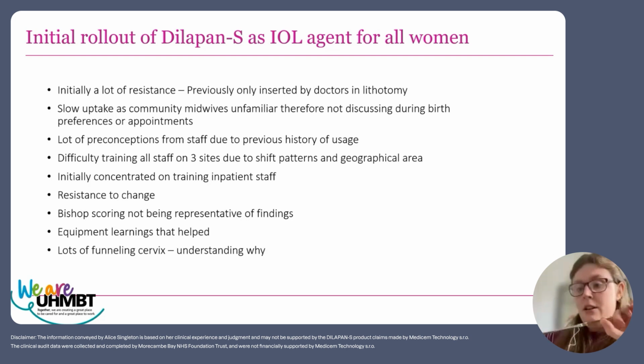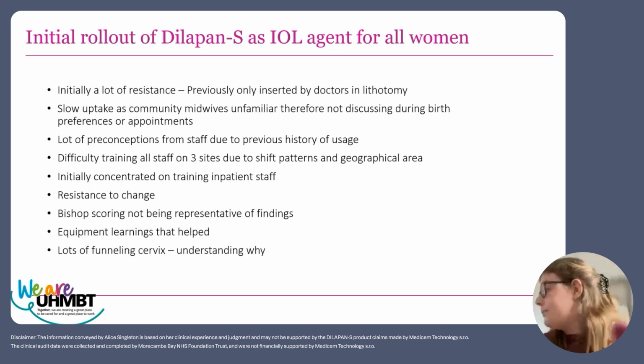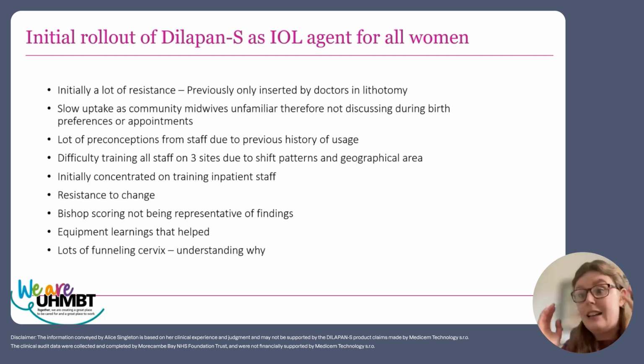So it means when you're in the patient with a cervix, it doesn't matter which method you've used, whether manual method or speculum, the Dilapan is basically going to go where you want it to go rather than going off wherever it wants to go.